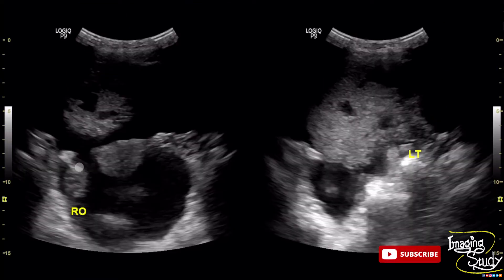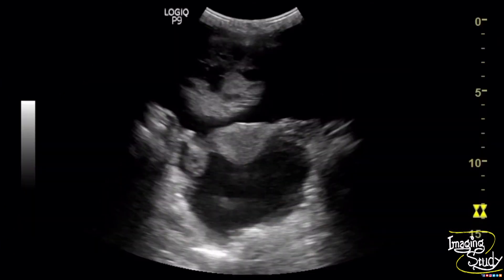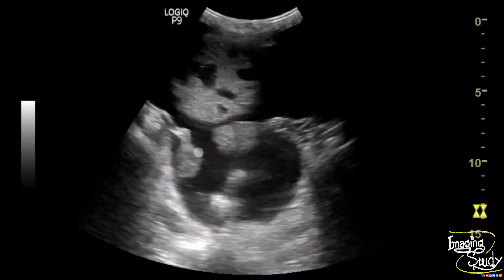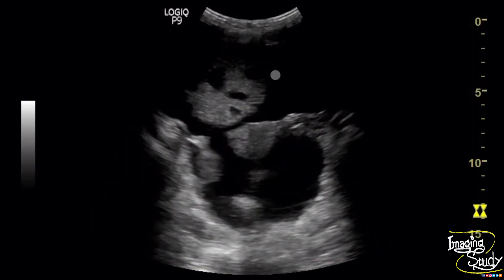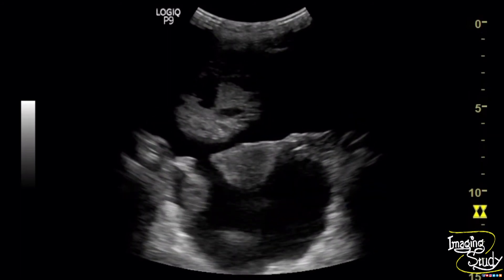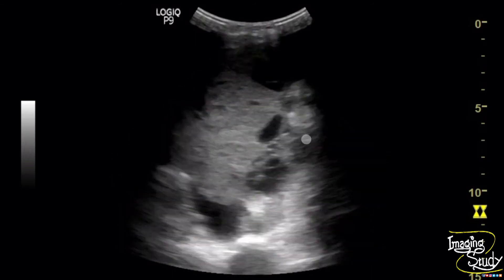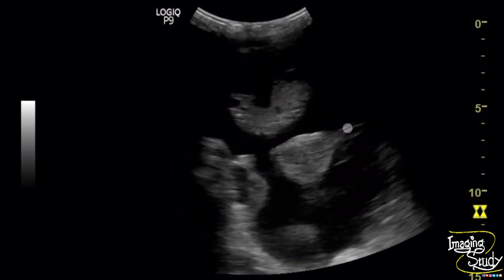Here is the transverse section of the pelvic region showing the uterus. This is the section of the right ovary, and you can see a huge amount of collection. Here is a glimpse of the mass, which when we tried to scan was coming from the left adnexa — we couldn't see the left ovary separately. On real-time imaging, here is the floating right ovary and uterus. You can see the mass is arising from the left adnexa, and the left ovary is not separately visualized.